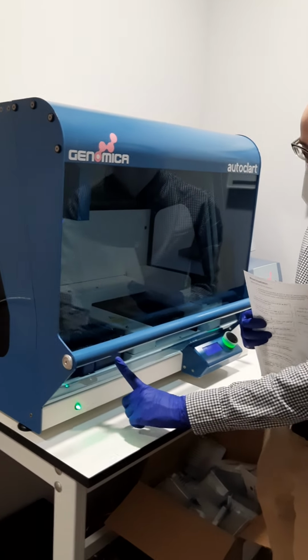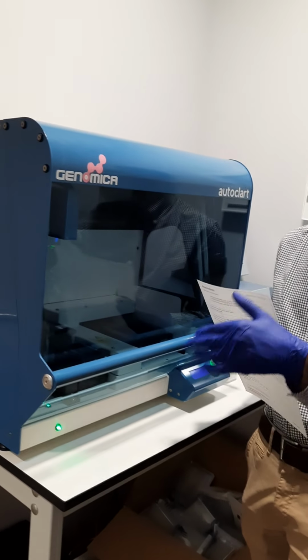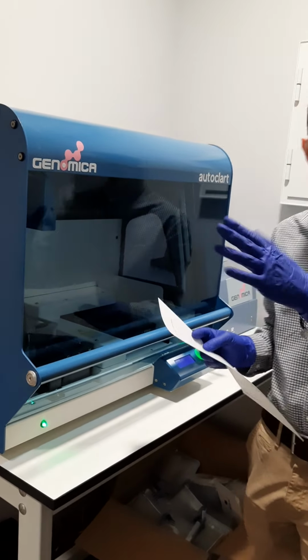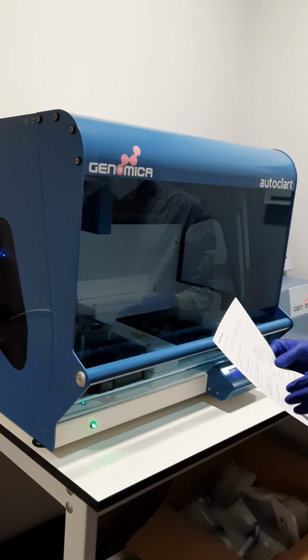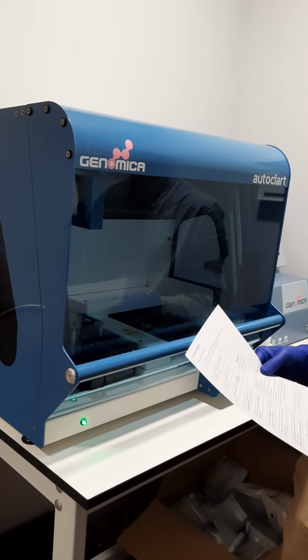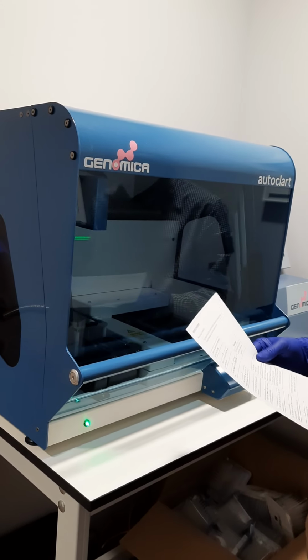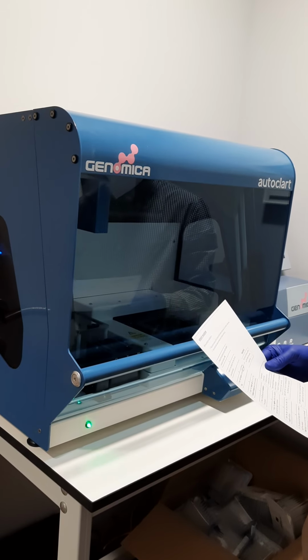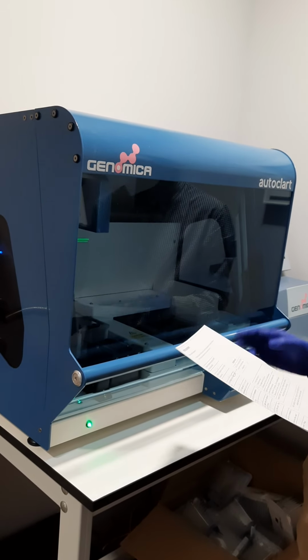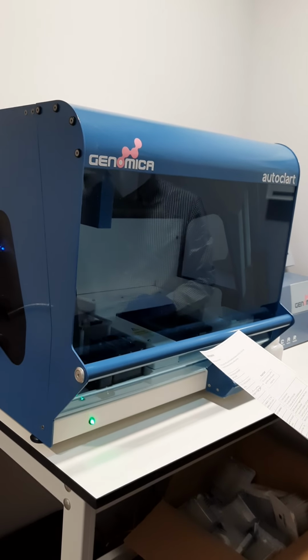the reagents. We have one that is the hybridization solution that can precipitate when it's at 4 degrees, the SDS and this kind of solutions. So we check, and if necessary we heat it at 65 degrees. We can put it in the same thermomixer at 65, and with the heat it's going to dissolve, so no issue. If it is precipitated? Yes, okay. It is the crystal. We generally do it by this vortex, just to homogenize the solution.